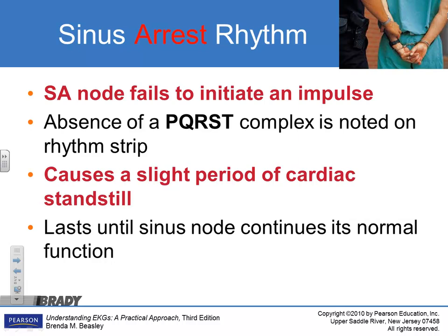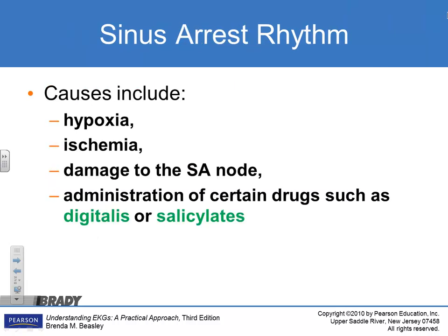You can't manage that for long, right? And at some point, hopefully quickly, the sinus node will pick back up and restart. These are always scary when you see this, particularly if they've missed a couple of beats. You're going, are they going into asystole? Then it picks right back up, so you kind of go, whoosh.